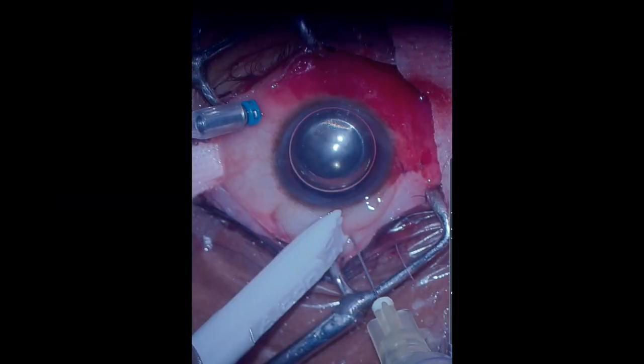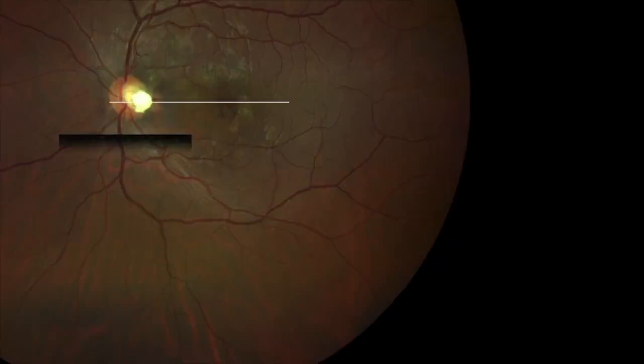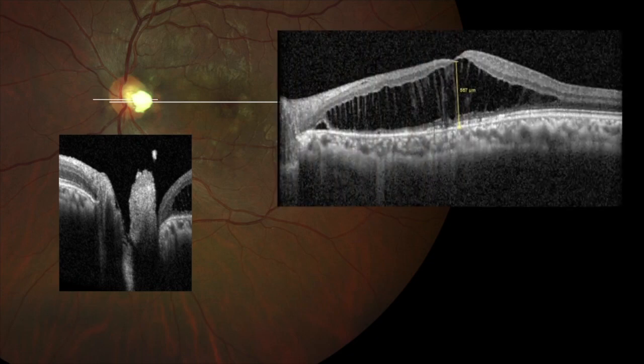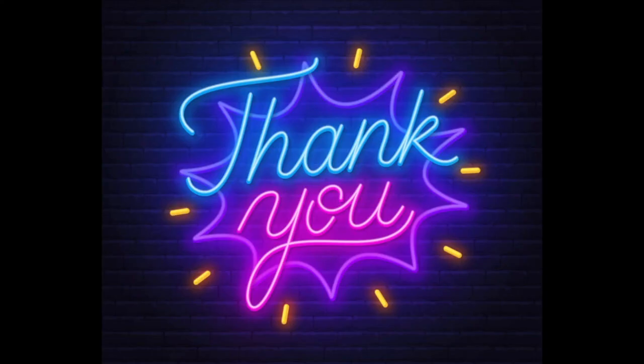Finally, gas was injected. This is the fundus photo of the first post-op visit with the scleral graft perfectly in position. And finally, in conclusion, we would say that careful fluid-air exchange is the mantra for proper graft positioning. Thank you.